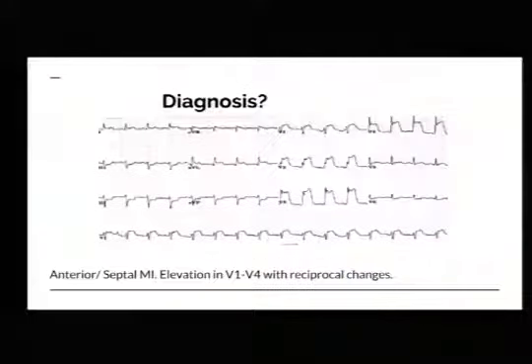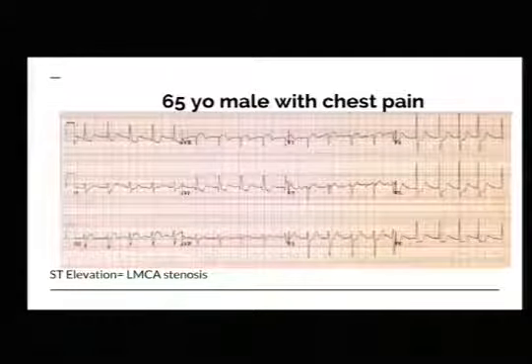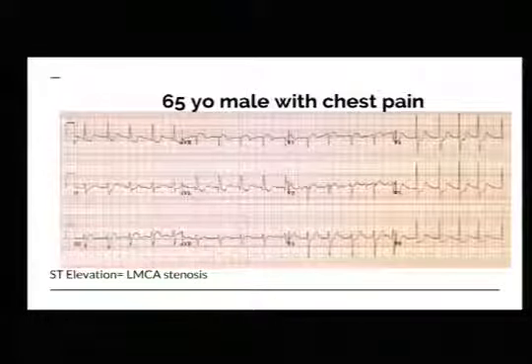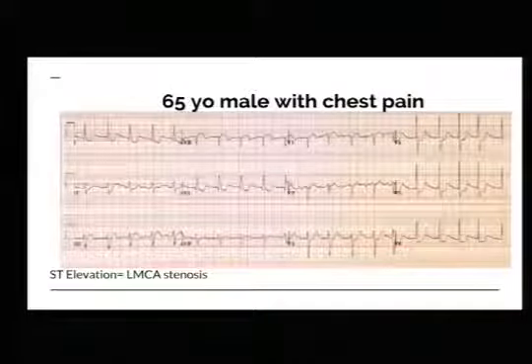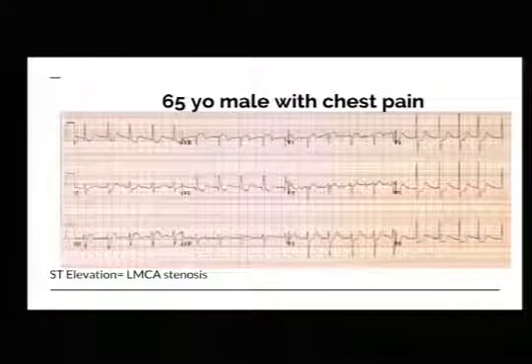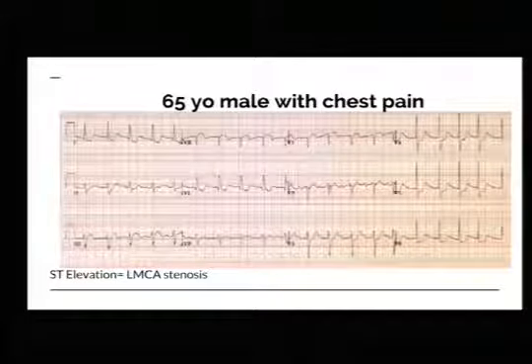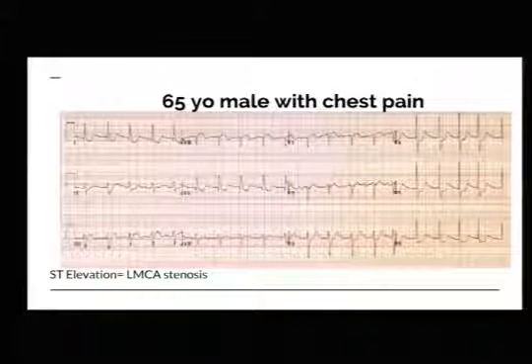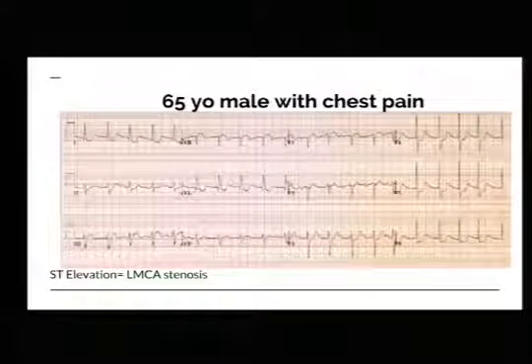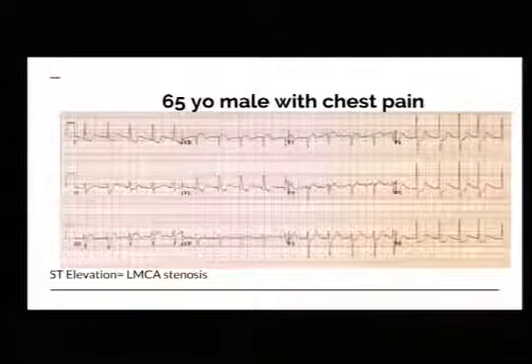So, oops, looking at AVR, when you kind of have some diffuse ischemic changes, can mean a left main. And I've had a cardiologist not want to take a patient to the cath lab, sat on him, waited until he VFib arrested, got him back, and then took him with a left main. So those new studies are showing those are bad looking EKGs, although they're not the pathognomonic tombstone lookings.